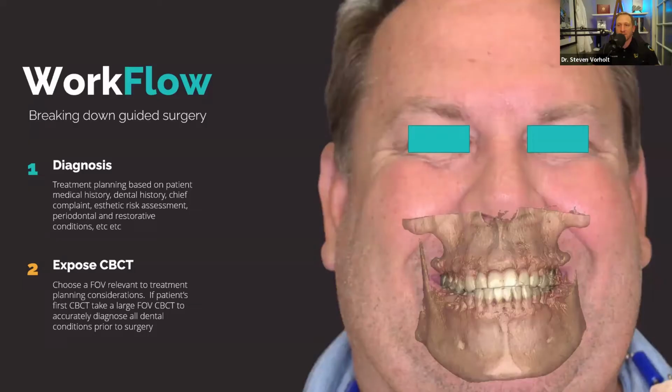Personally, I never billed for a CBCT. The data I got and the impressions I got from my patients was more than worth the $200 or $300 I would try to get from it, especially if that meant doing it on less patients. So when we expose our CT, we're going to choose the field of view that is most relevant to the treatment planning we are trying to consider.